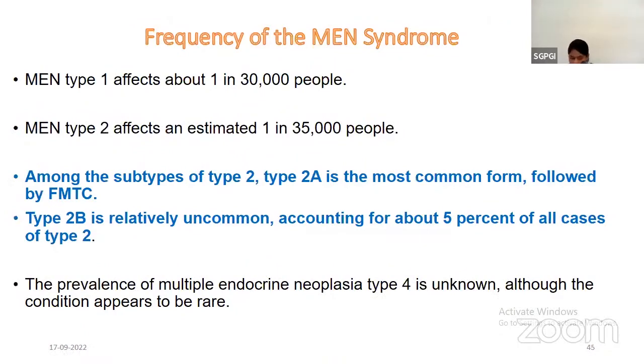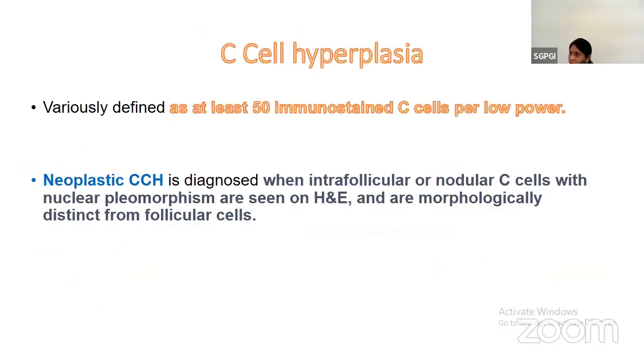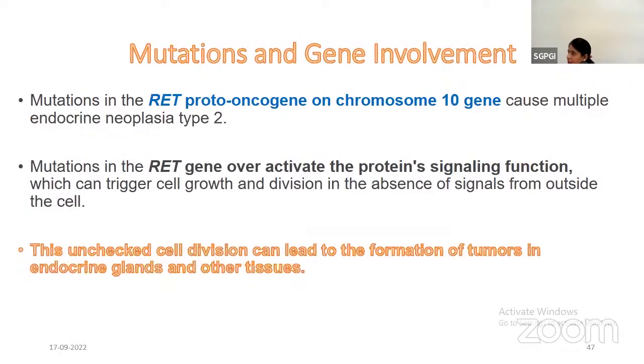Any questions? Do I have time to discuss this, or any? Should I discuss? So, very interesting case, and MEN cases always have the spectrum of lesions that can pose an enigma, and also a challenging range of findings that can come across. Any comments or questions to the presenter?